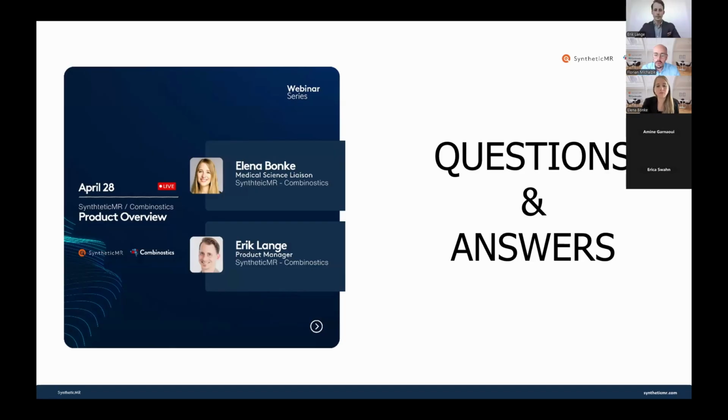So first question, which goes to both of you, maybe, because it was just mentioned a couple of minutes ago from Erik as well. So, Erik, you mentioned that the outputs can be customized, which are going to be sent back to the PACS. So that's going to answer one of the questions. So is it possible to choose what outputs to receive in PACS? So maybe, Erik, as you just described it, you can go first.